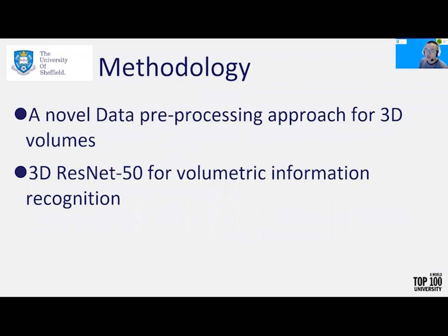Next, let's turn to our contribution and originality. Generally speaking, our method includes two critical sections, a novel data pre-processing pipeline and the pre-trained 3D ResNet.